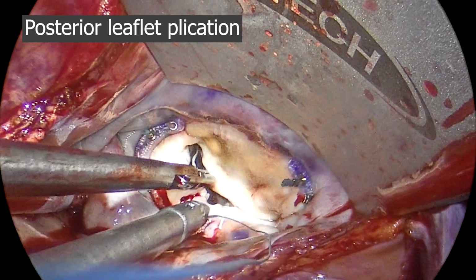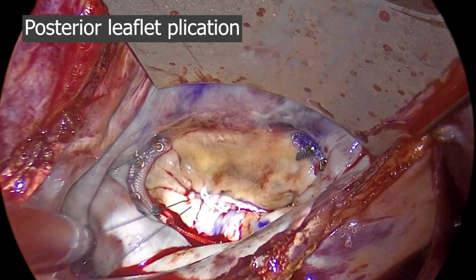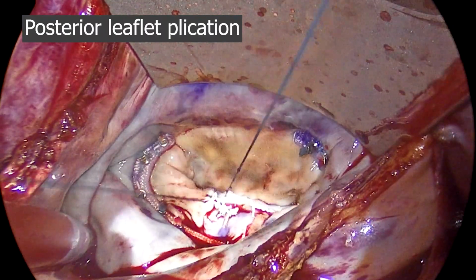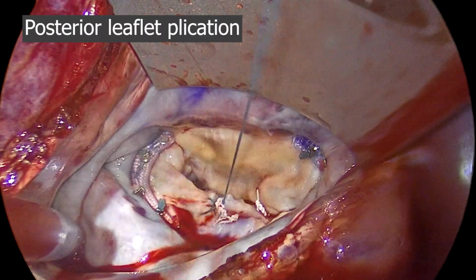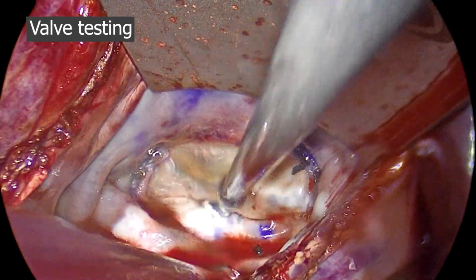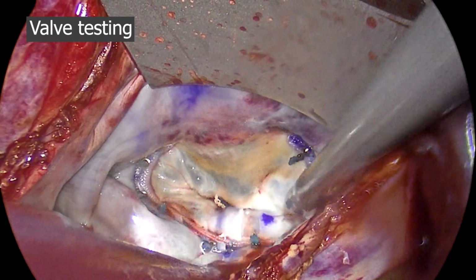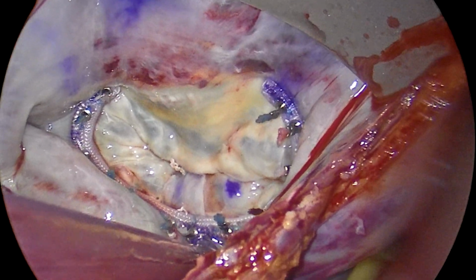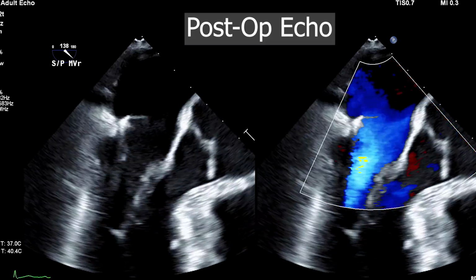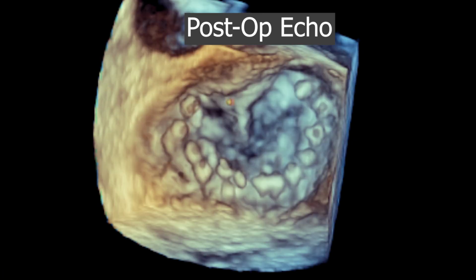We plicate the cleft at P1, P2 using a 4-0 ethobond. Final testing shows that there is no longer residual mitral regurgitation. His post-operative echo demonstrates good valve and ventricular function, as well as normal mobility of the posterior leaflet. There is no residual mitral regurgitation, and the valve now has good coaptation.